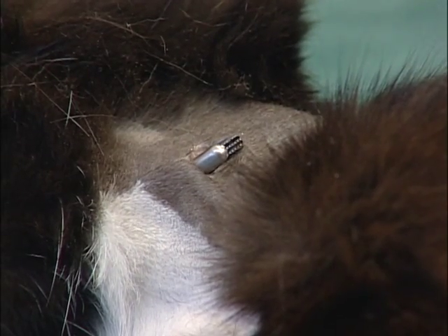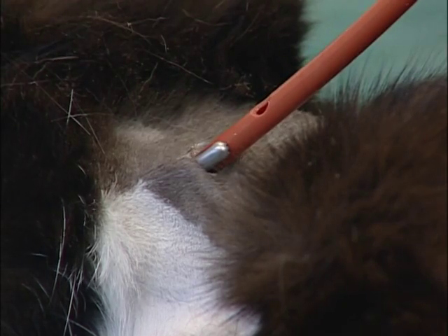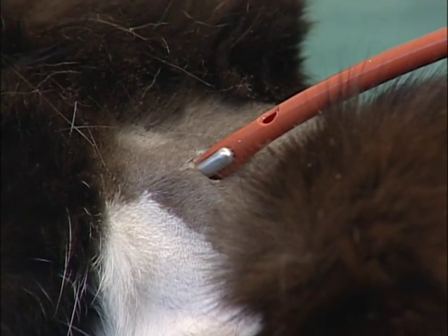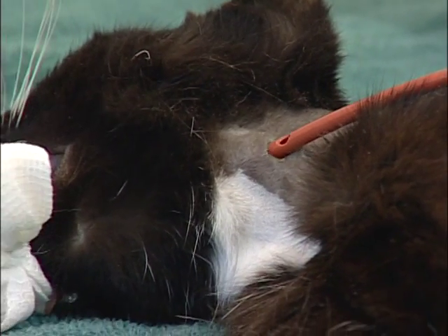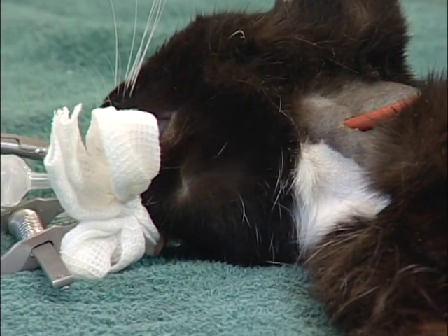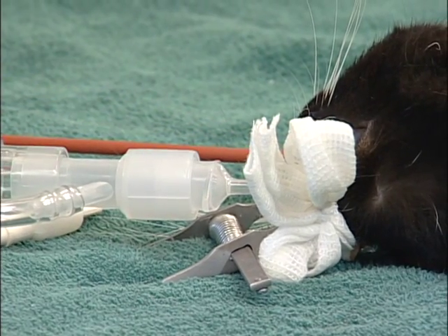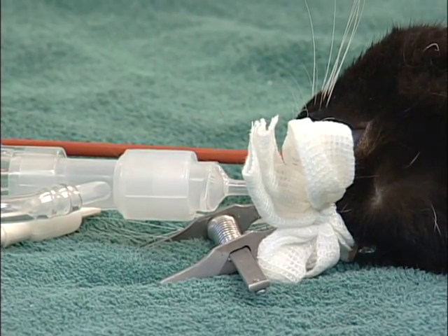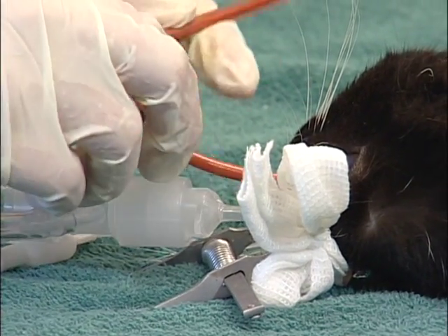Once you're through the skin, open the forceps and go ahead and grasp the tube. Then pull the tube back through your opening and into the mouth. At this point, you're going to turn the tube back on itself and push it back down into the esophagus.